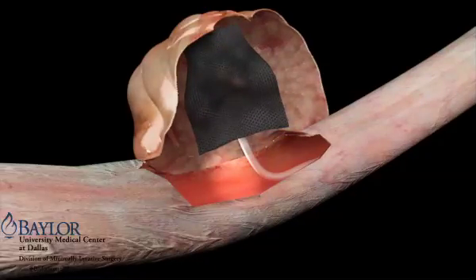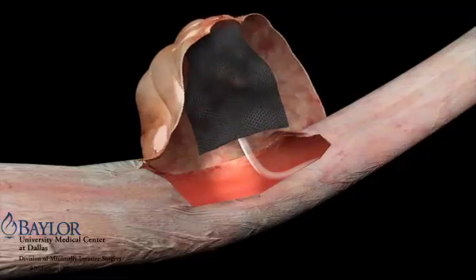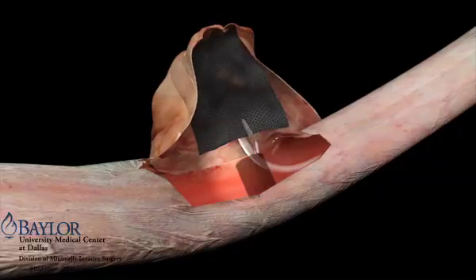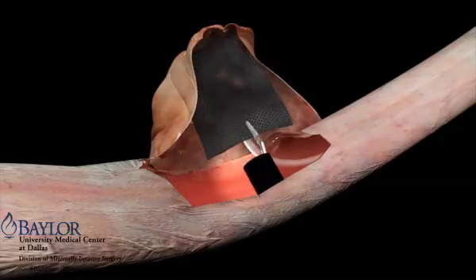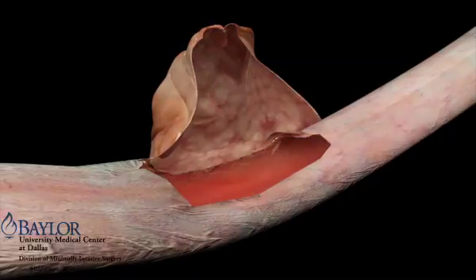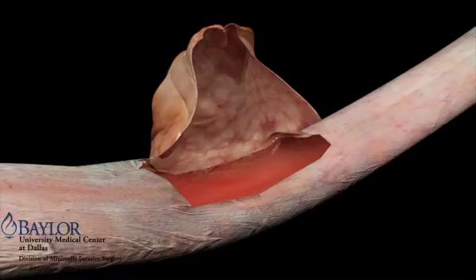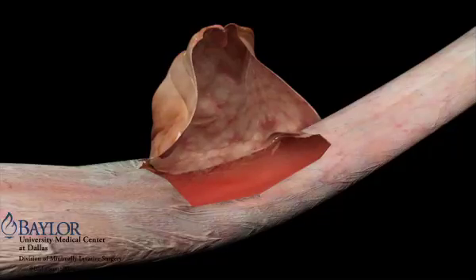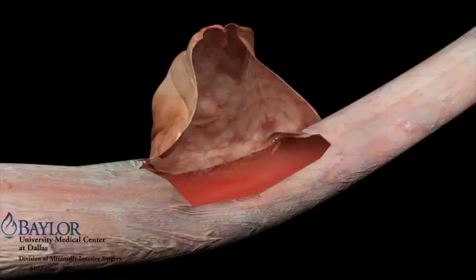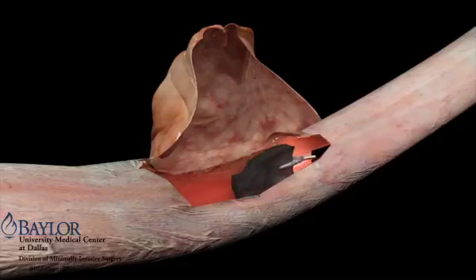With a large cavity, it is essential that the endosponge be placed extraluminally to facilitate collapsing the cavity. Once negative pressure is applied, the cavity will collapse around the endosponge.